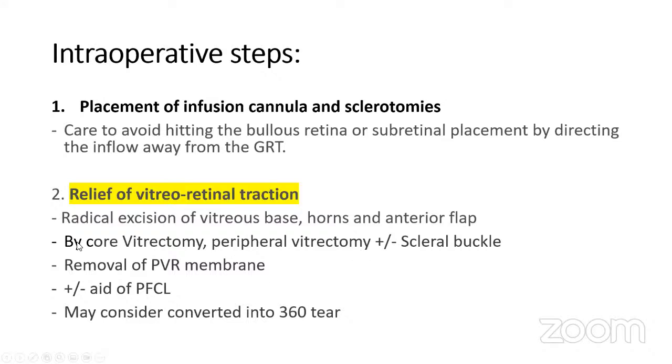However, removing the anterior flap can be quite challenging in certain cases, especially in the phakic eye, on top of a very bullous and mobile retina.